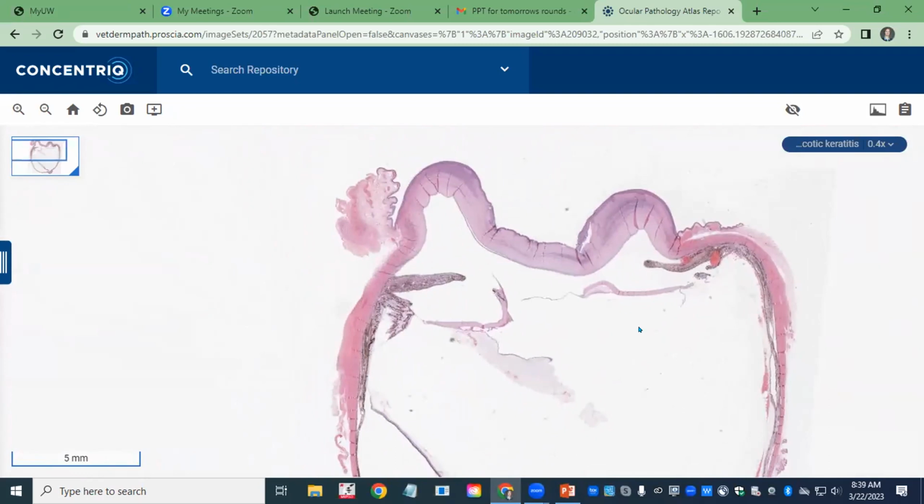These features are not unusual in our hands as far as post-phaco emulsification eyes after cataract surgery that end up in jars on our counter. So they often will develop secondary glaucoma, and that is the reason why they're enucleated and sent to us. I'm not saying that all cataract surgery eyes end up with glaucoma. That's the careful point I'm trying to make. But we are biased as ocular pathologists because that's all we see. Anyway, I hope that most of them are successful in the long term.